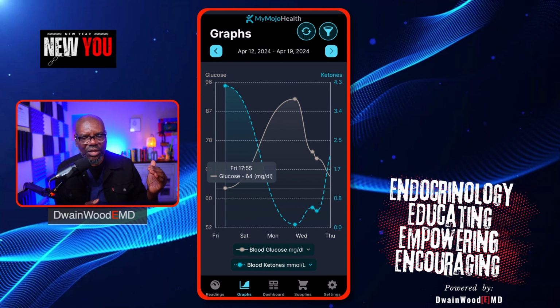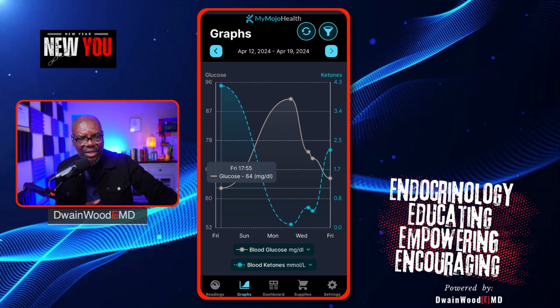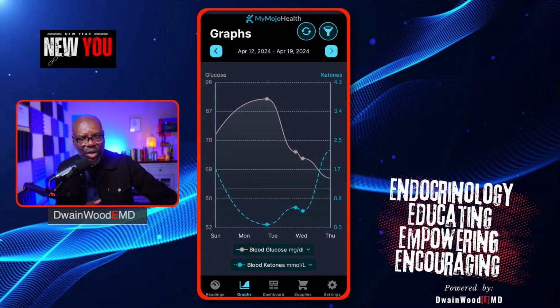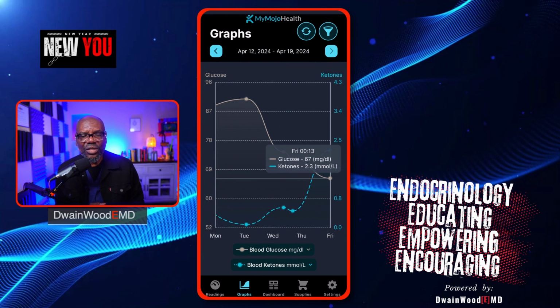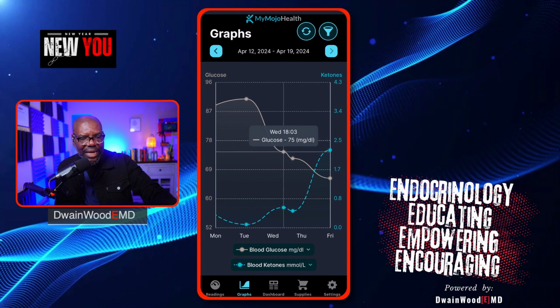But as I started fasting and the blood sugars are going down, the tan line is getting lower and lower, you see that the ketones start to go up and they cross there. And now at the end, you'll see that that's where my ketones are, the ones that we just saw, 2.3 with glucose of 67. So I love seeing that, because that means that my body has switched from burning glucose to now burning fat, y'all. Right? This stuff right here, some of that's going away right now as we're speaking, because the body is in the process of burning that up and using ketones in its place, right?